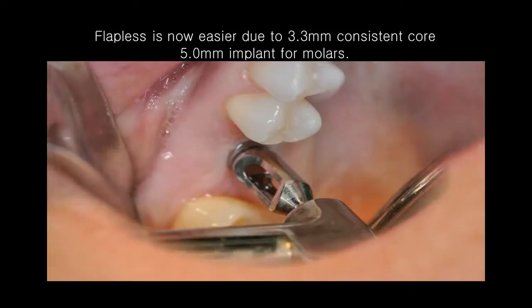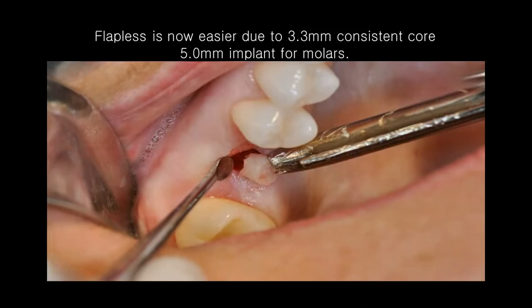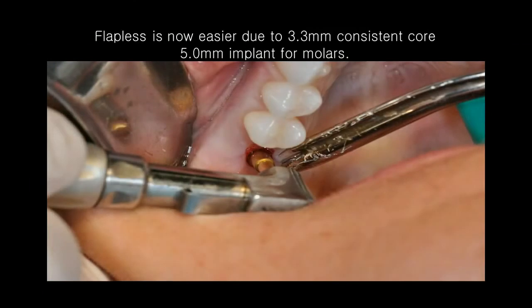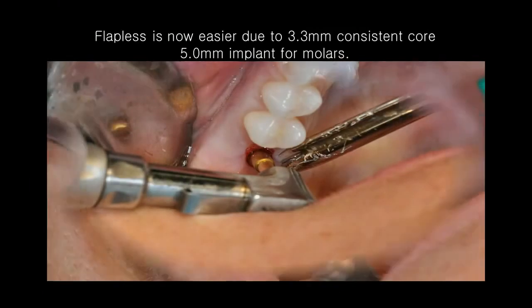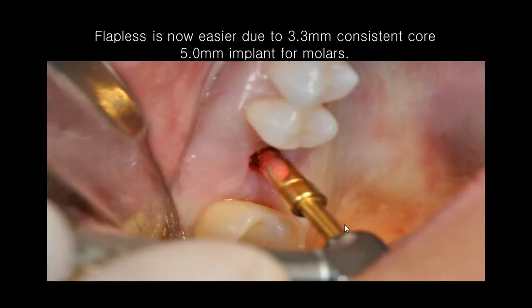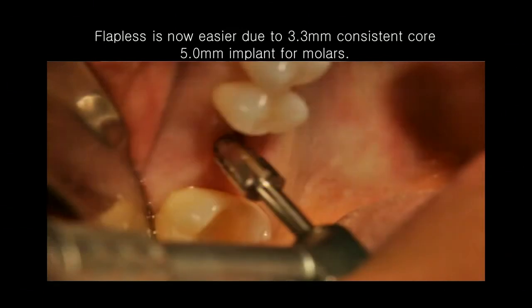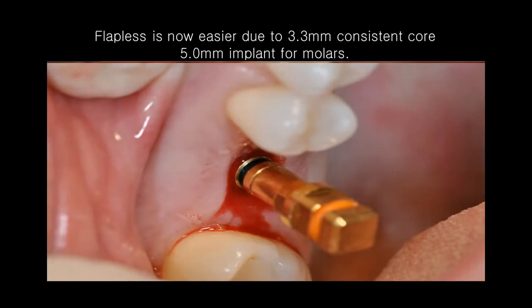Here's your tissue punch. And there we're going to go ahead and remove your tissue punch with your molt. Go circumferentially around it. Use your stopper drills, which are really nice, again, especially when you're close to the sinus. Here's your hub, as you can see there, and there's your stopper drill itself. So your hub always stops you from going down into any sort of anatomical structures, and these drills do harvest bone nicely as well. Okay, now also, here's your cortical bone drill, which we're going to show in just a second a little bit further, but I'm just showing a clinical case now.